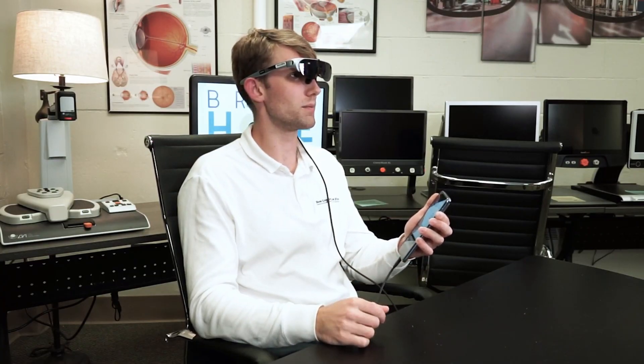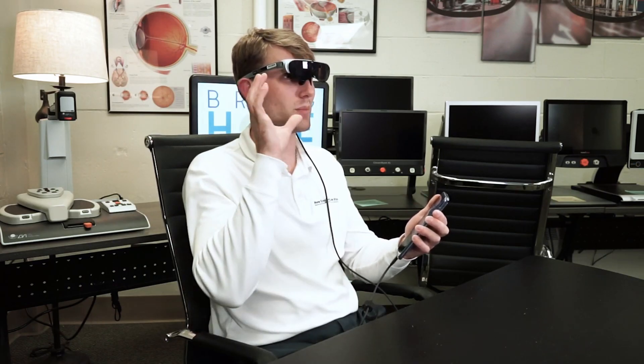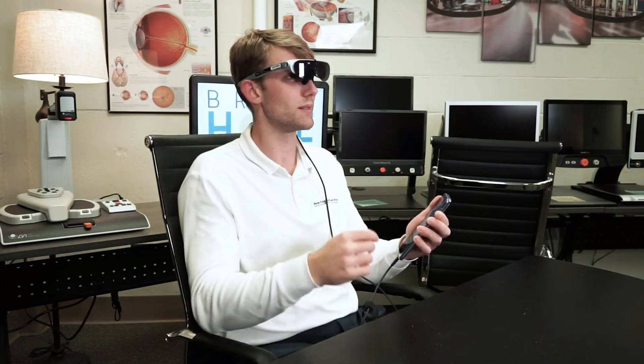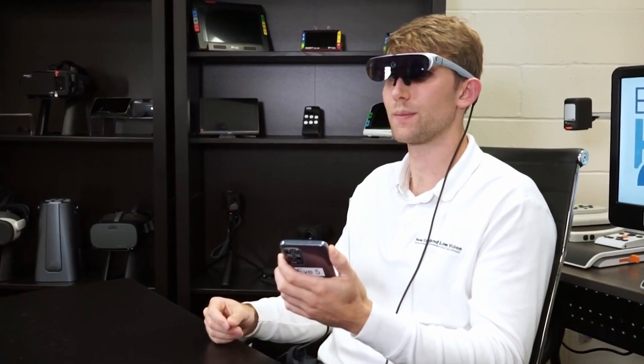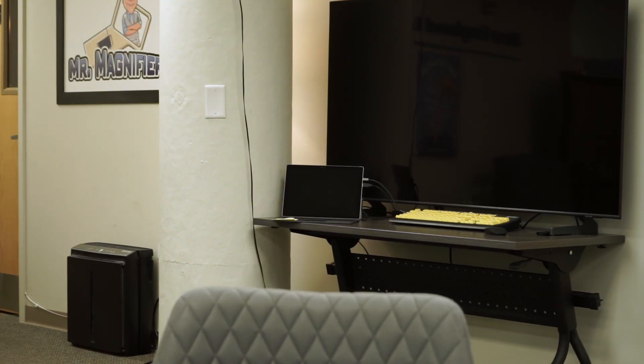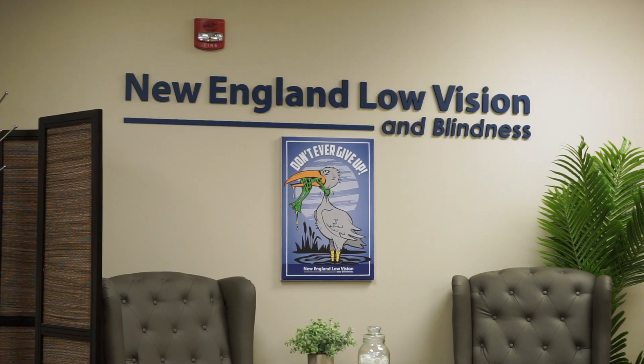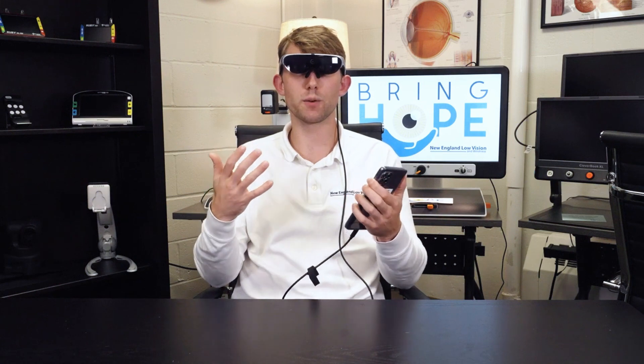What is in front of me? Once it understands what I said, it's going to have a bubbly noise which is the loading sound. The AI responds: 'There is a setup that looks like a small studio or office space. There is a bright light on a stand, a table, a laptop, and some pens and other equipment. The wall has some signage related to New England Low Vision and Blindness.' So it just described the scene that was in front of me.